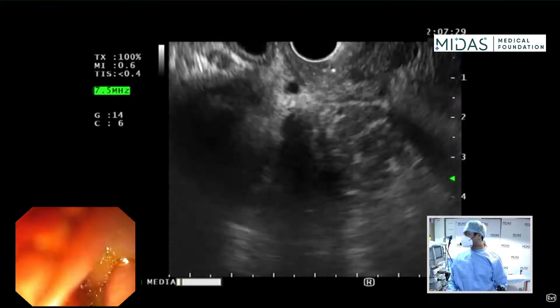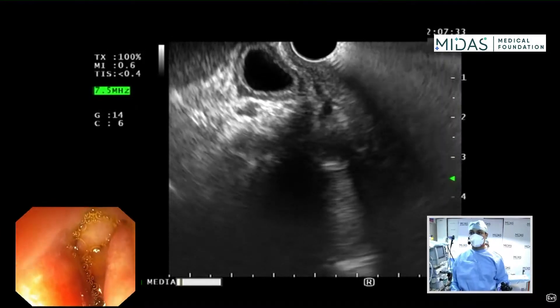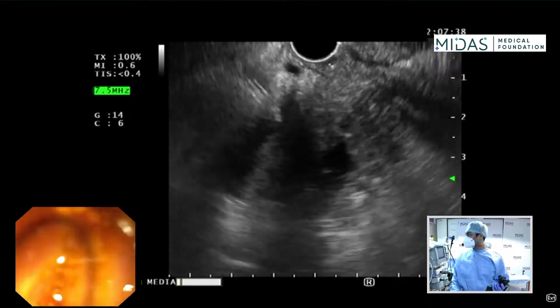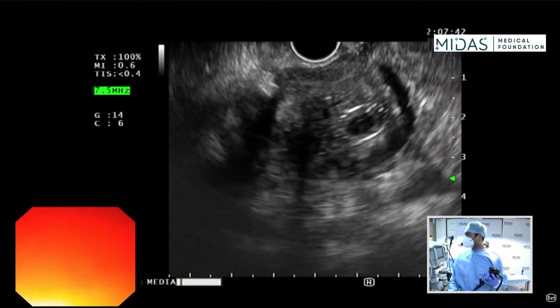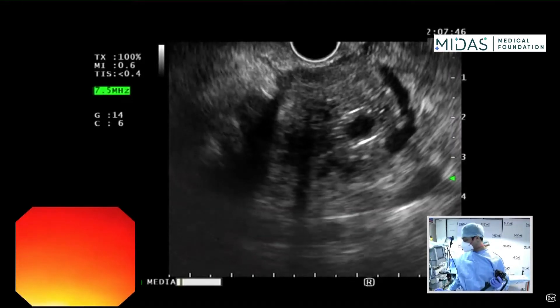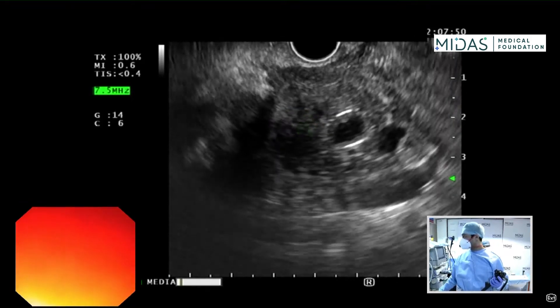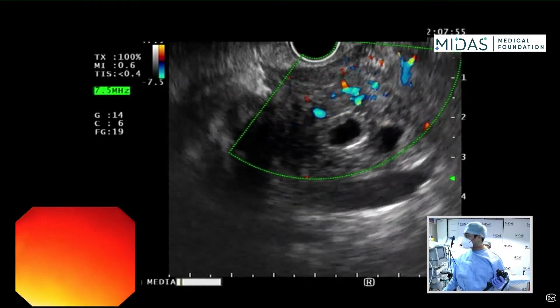As we start the FNB of the mass, we need to get a good position. I'm going to move the scope back and forth, use suction to take all the air out, and do gentle clockwise and counterclockwise torque. Now this is a reasonable position — I can see the mass right here.